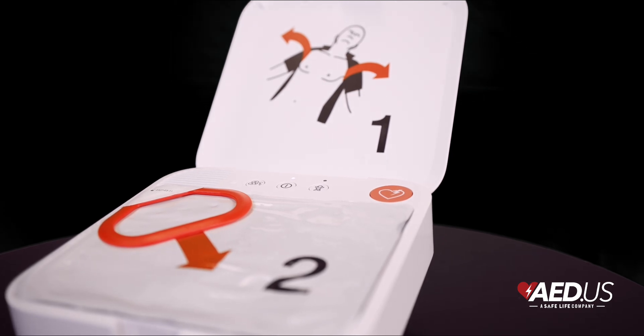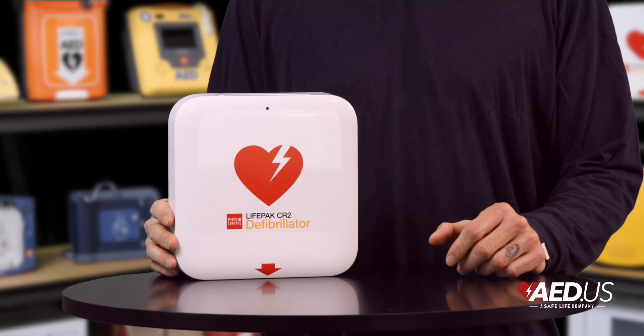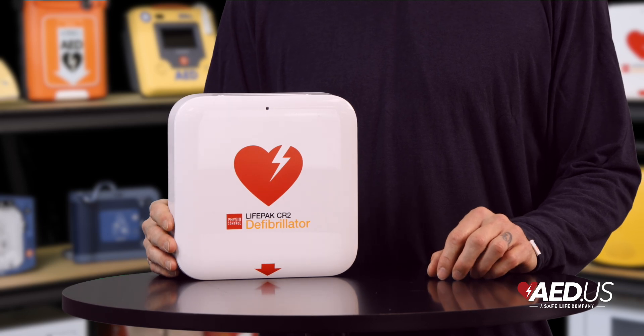The child mode button makes pediatric rescue simple, adjusting energy levels for younger patients without the need for a separate pediatric pad. This versatility ensures the device is always ready no matter the patient's age.